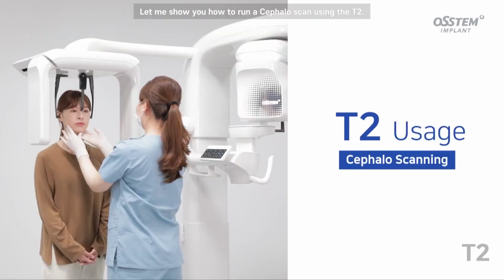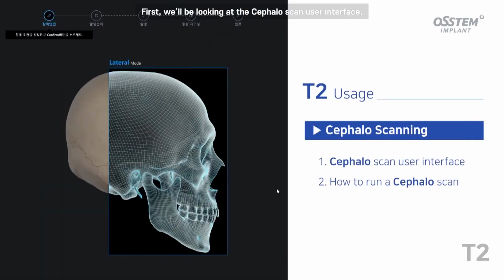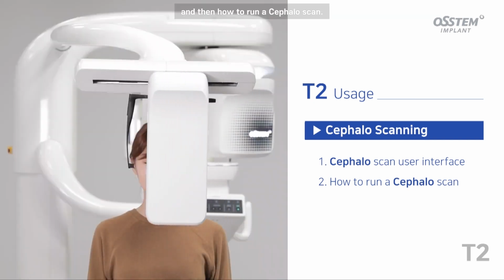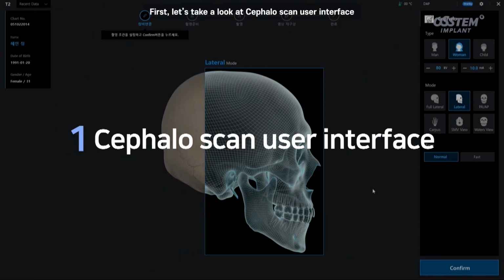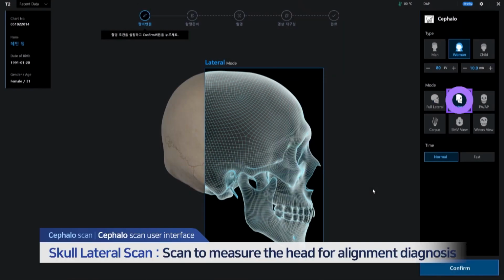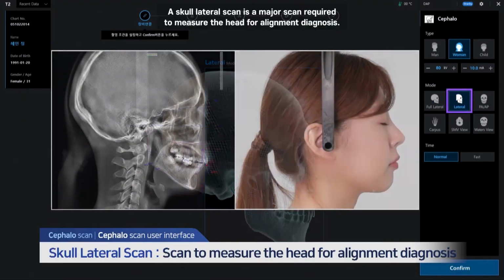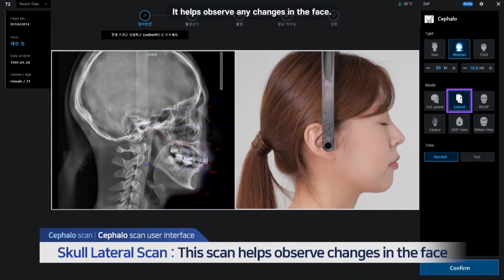Let me show you how to run a cephalo scan using the T2. First, we'll be looking at the cephalo scan user interface, and then how to run a cephalo scan. First, let's take a look at cephalo scan user interface. There are 6 scan types available in cephalo scan mode. A skull lateral scan is a major scan required to measure the head for alignment diagnosis. It helps observe any changes in the face.